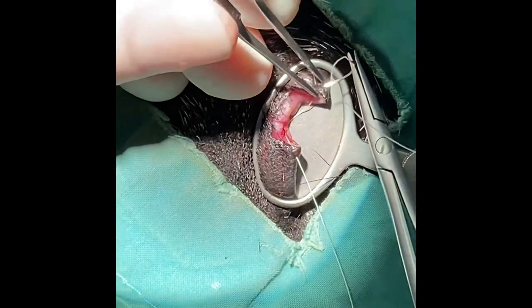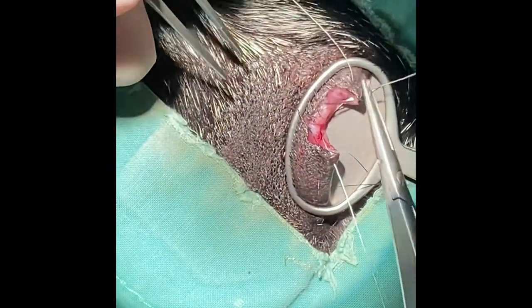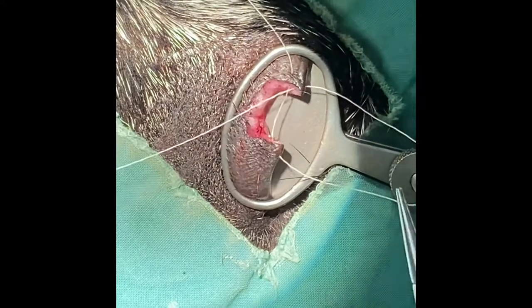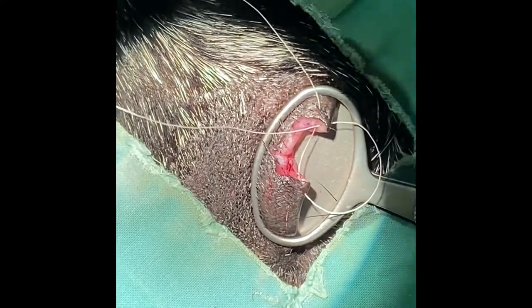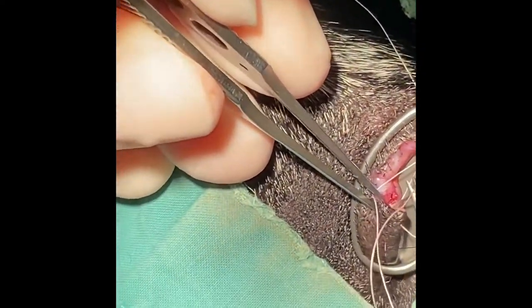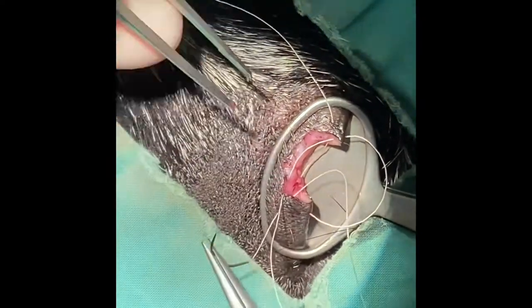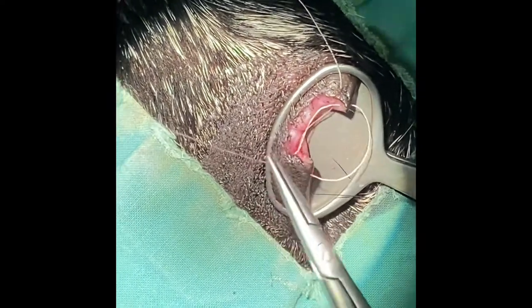Coming out about one millimetre along the eyelid margin, and on this side we're trying to match it symmetrically, so going in one millimetre along that eyelid margin, exiting about two millimetres proximal to the eyelid margin out of the wound itself, then going across to the other side of the wound, entering about three millimetres down to come out on the skin three to four millimetres away — essentially trying to get that symmetrical appearance all the way along, so whatever I do on one side I am accurately placing on the other side to create a figure of eight with that suture.